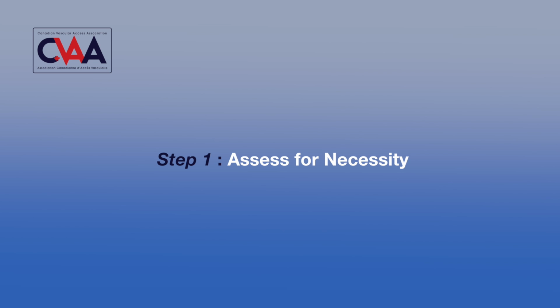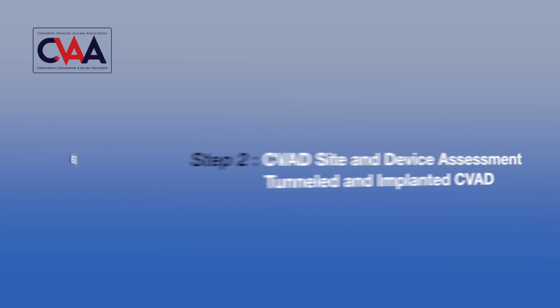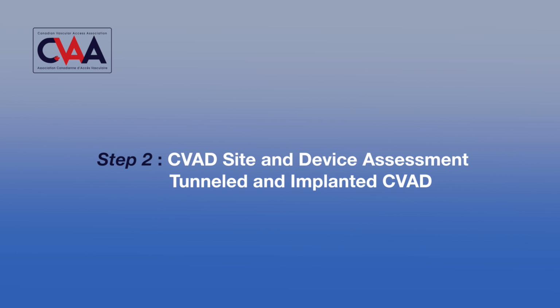For the purpose of this video, our CVADs have been deemed necessary, and the next steps of a CVAD assessment will now be demonstrated. Step 2. CVAD site and device assessment.